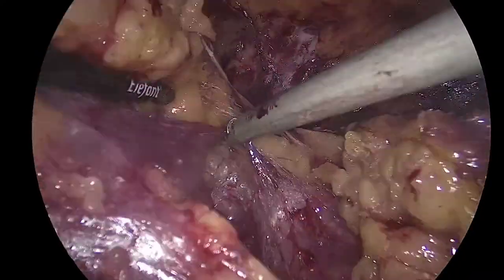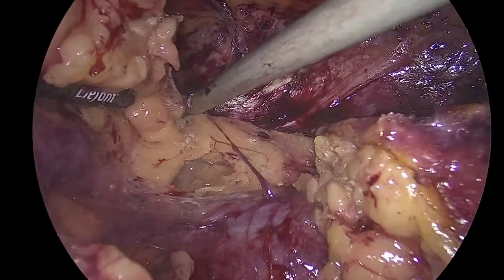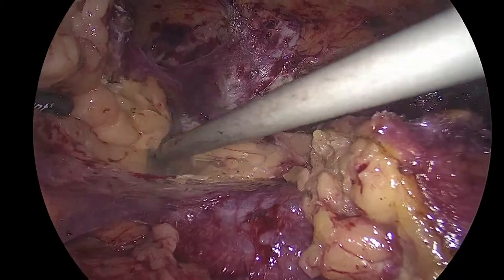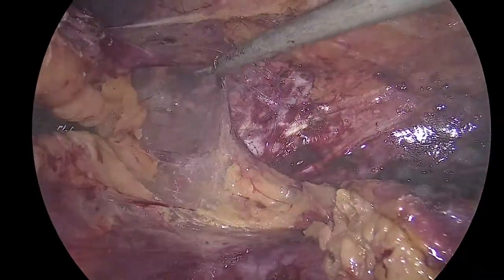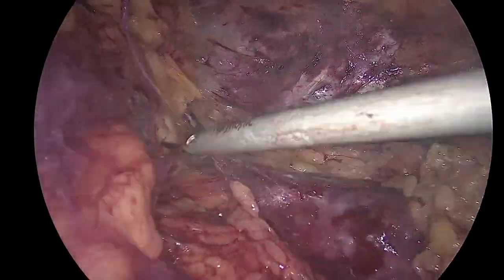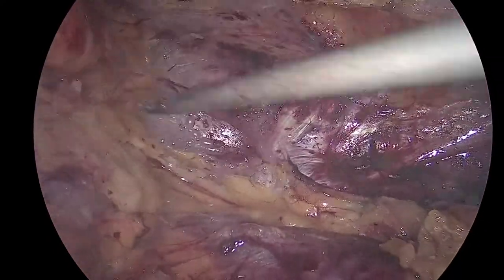You see that every time I make a change of movement, I ask, show me the ureter. Once you get burned once, you're very careful, eh? Again, look at this movement here. You have dissected everything, so everything is nicely approachable here. Good. Okay.